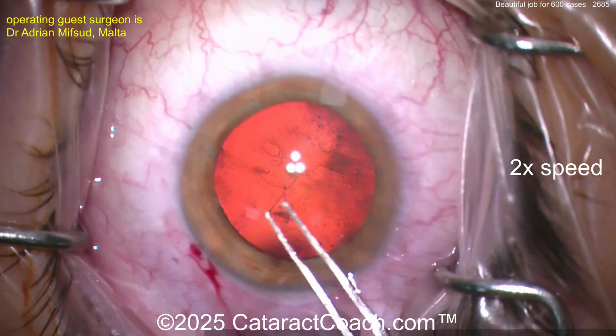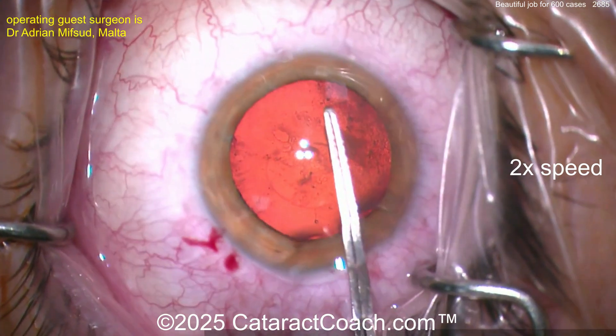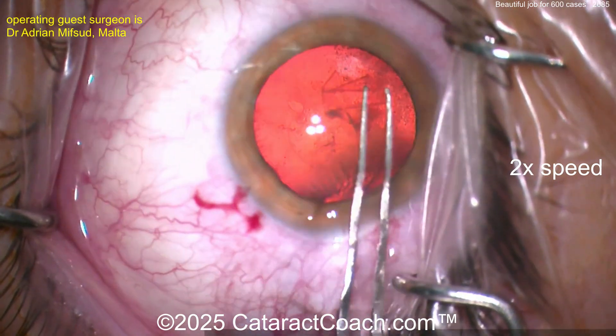Now let's see the rhexis just with forceps. Getting that created pretty nicely here, and it looks nicely centered up as well.